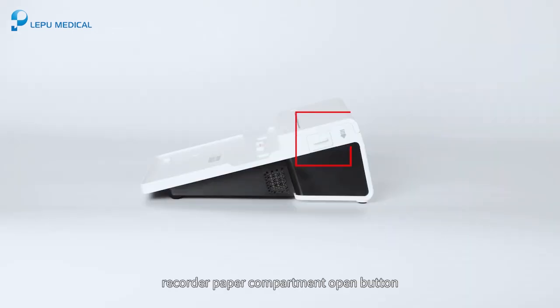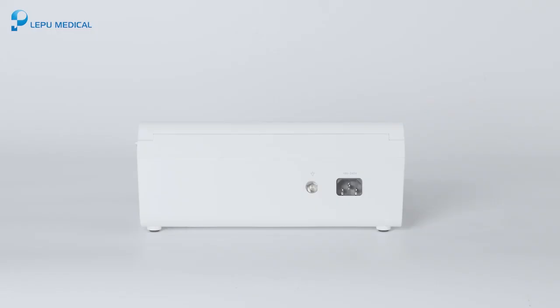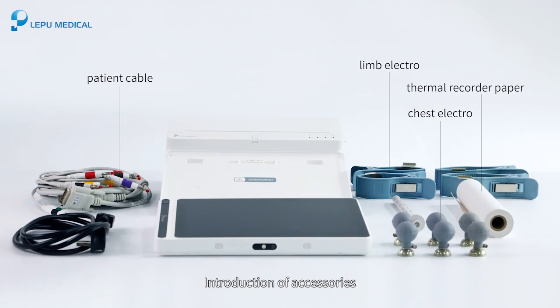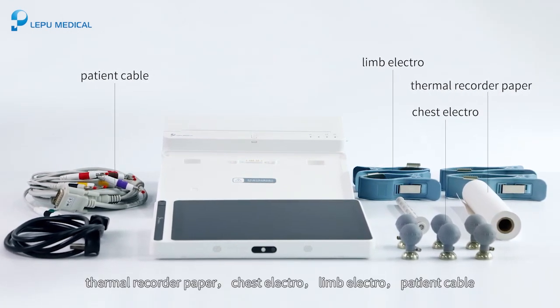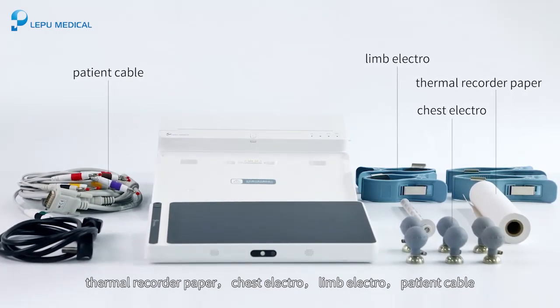The right view of the recorder base shows the recorder paper compartment open button and ventilation holes. The top view has the DC power socket and equal potential grounding terminal. The accessories include thermal recorder paper, chest electrodes, limb electrodes, and patient cable.